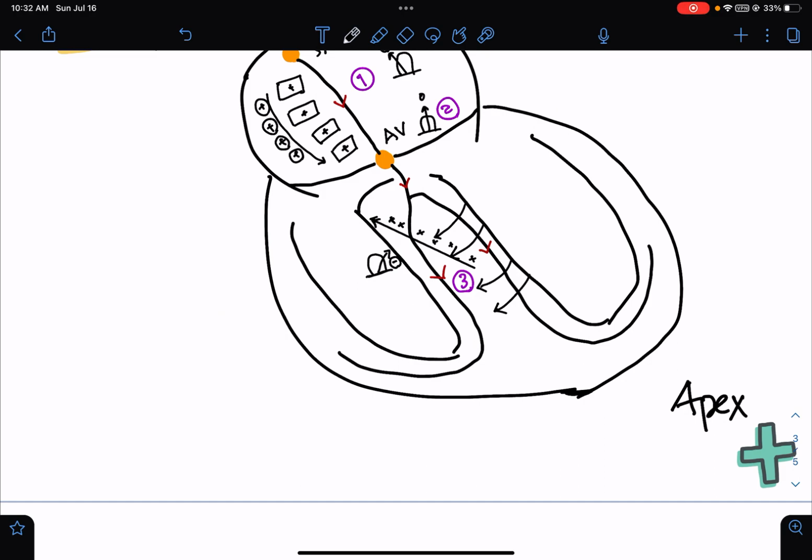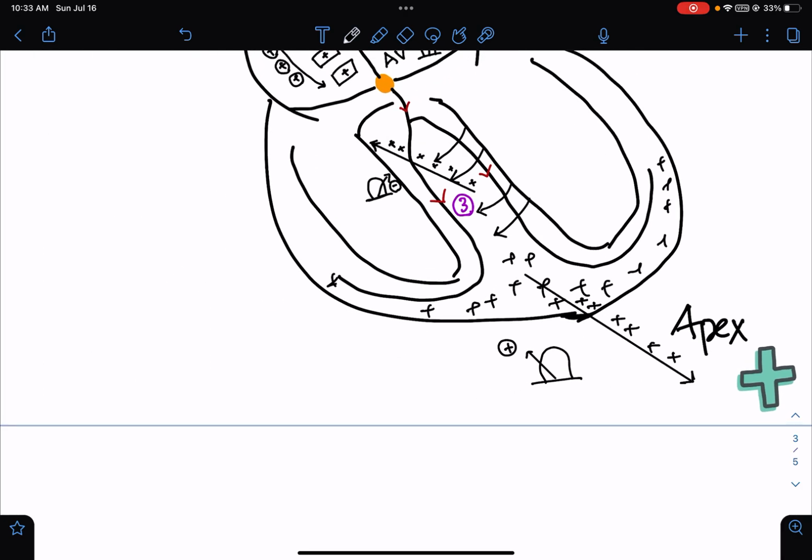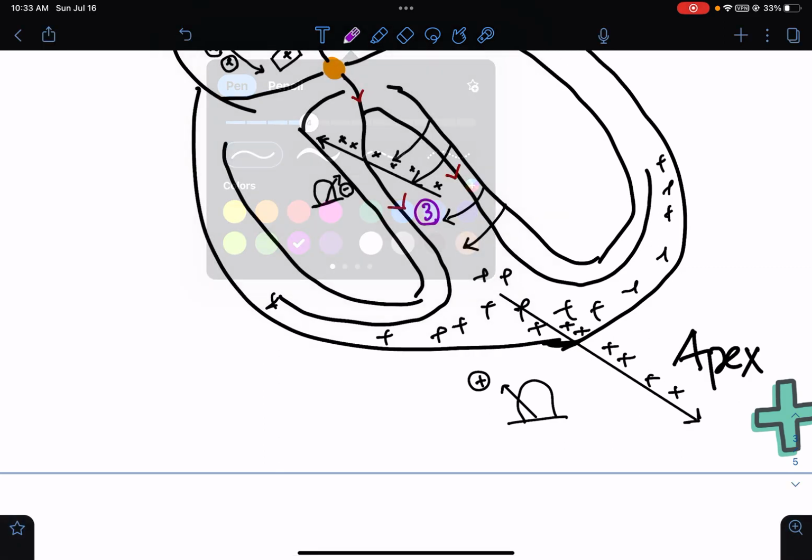Okay. So let's see the major myocardial contractions. If there is muscle contraction in our myocardium, there will be a lot of positive charges, right? Positive charges, positive charges. Here also positive charges. If there are positive charges, the depolarization arrow moves like that, and the positive vectors carry the positive charges and move to the positive pole. So what happens? Here is your galvanometer. It will indicate positive, right?